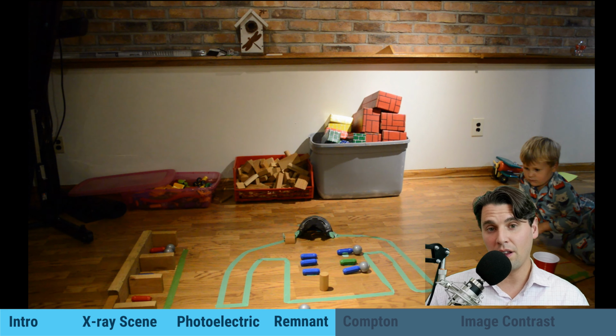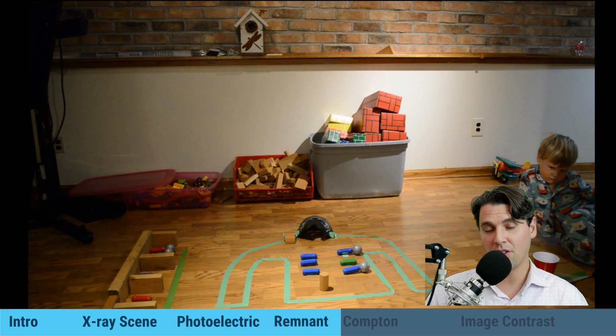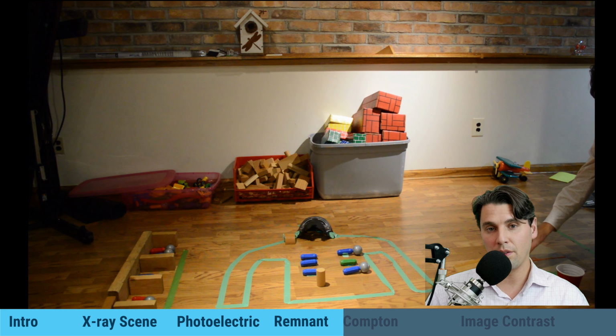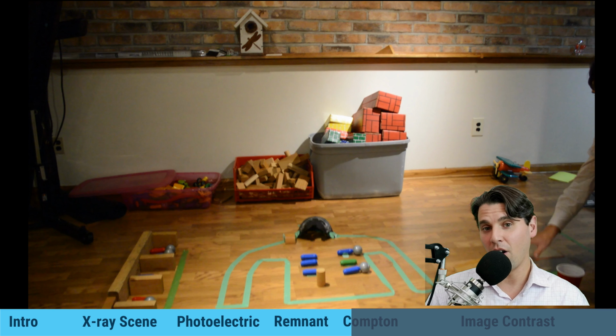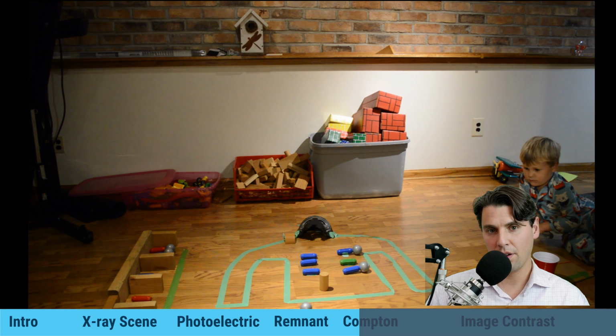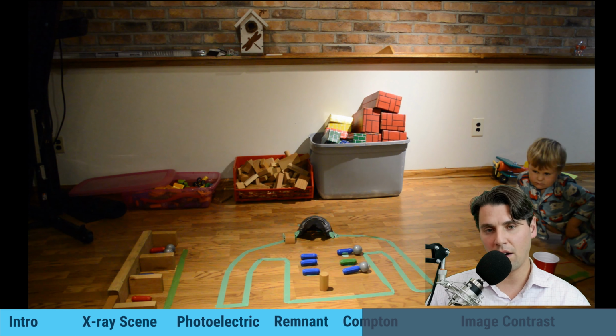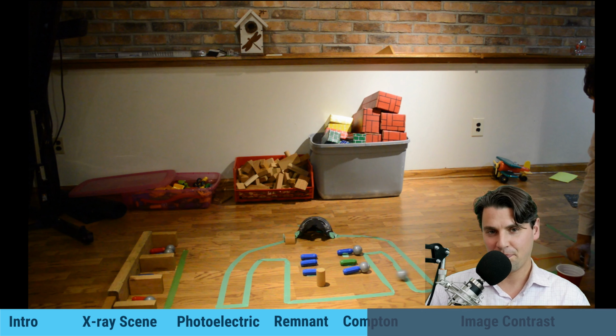The X-ray could either scatter just slightly and still be measured on the detector itself, or it could scatter significantly and outscatter and not be measured on the detector at all. But in general, the X-ray scatter will be forward focused, so more of the X-ray scatter will be in the forward direction than coming off to the side.